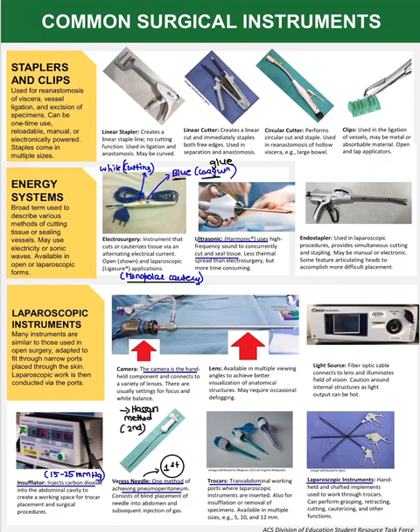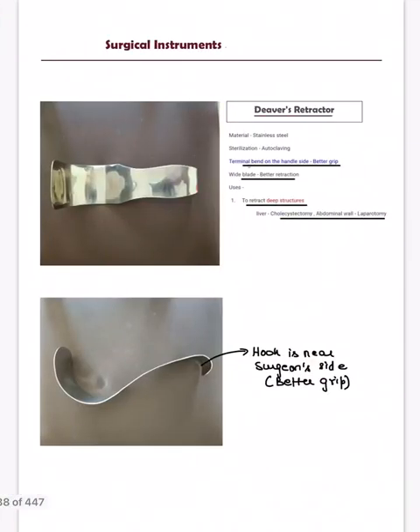Now laparoscopic instrument, if you see, this laparoscopic instrument has a camera, and these are the trocars, okay, through which it is inserted, and then through this we insert the instrument. These are the laparoscopic instruments. So we have two methods of creating the pneumoperitoneum. One is using the Veress needle, and other is using the Hasson's method. And here in laparoscopy we use CO2, at a pressure of maximum around 25 mmHg, 15 to 25 is used.